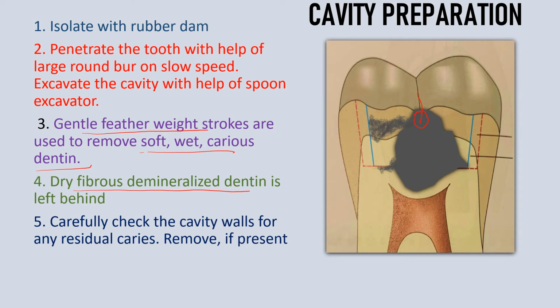After that, we carefully check the cavity walls for any residual caries. In case there is any caries present on the walls, we remove it.